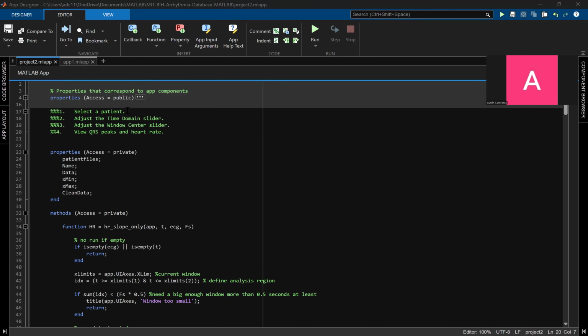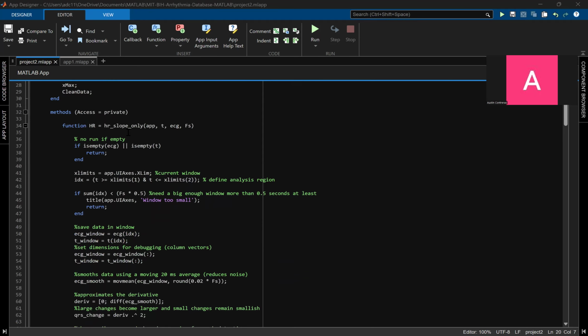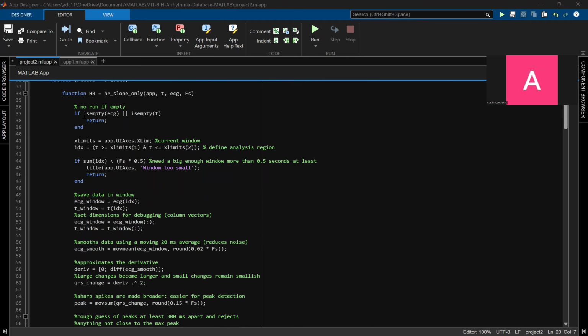Just select the patient in the list box, adjust the time slider to find the time domain that you want to look at, and then you can view a specific window in that time domain. The peaks and the heart rate will be calculated automatically in whatever window is there. So it's fairly easy.